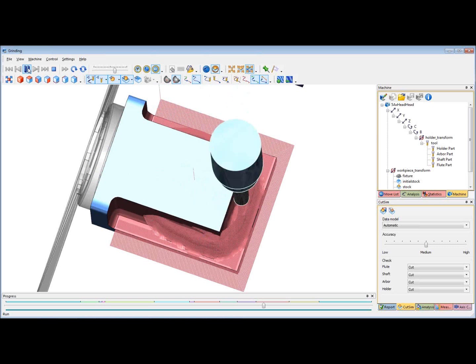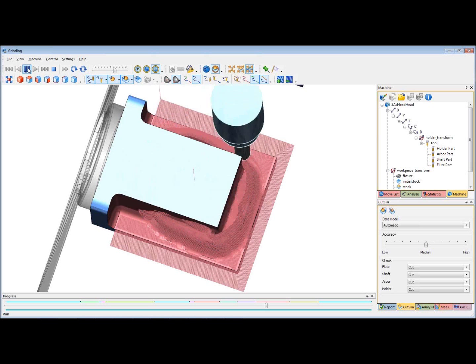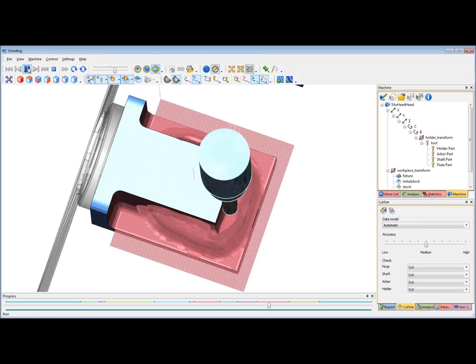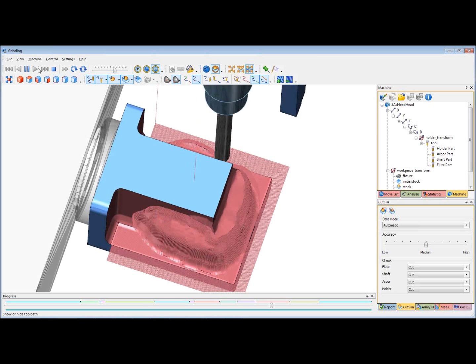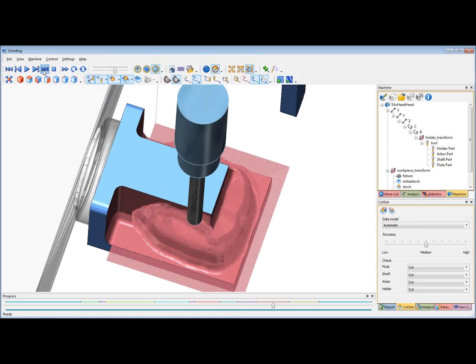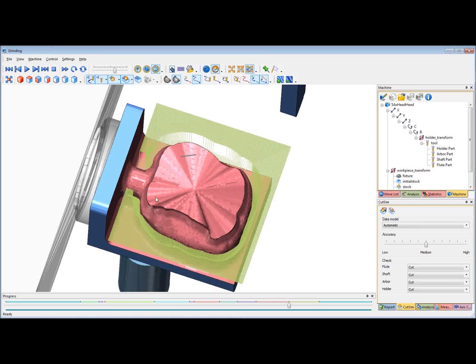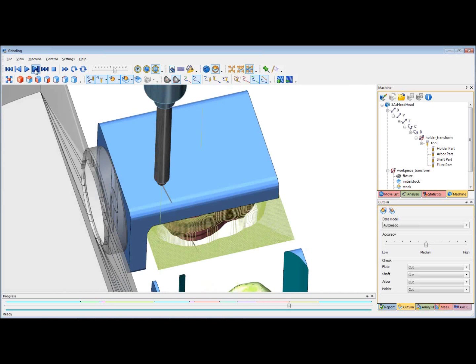So this is roughing only on the outside, and then we will have a different tool path to rough and finish inside the cavity. We have a similar U-shaped cycle on the occlusal side.